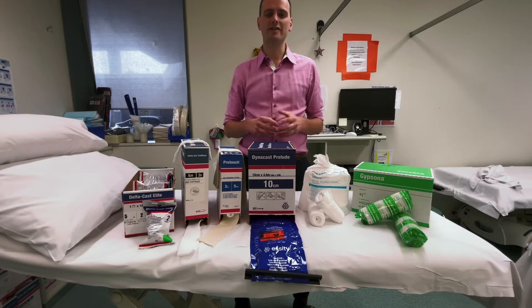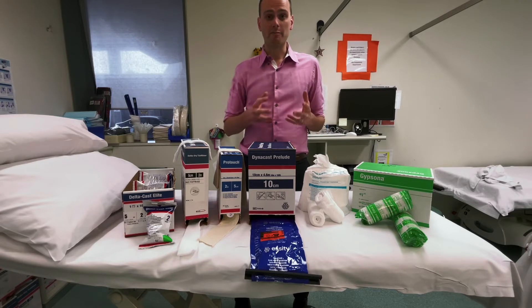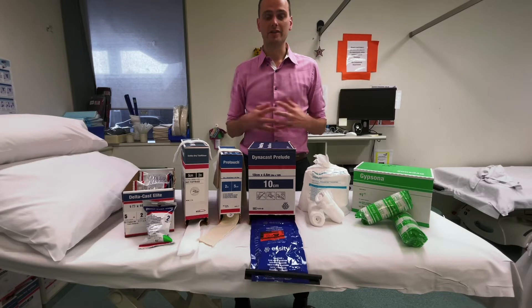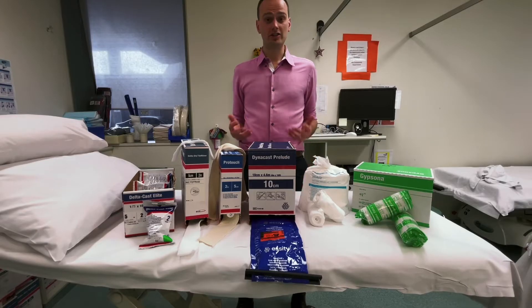Welcome back to the Osteoclass channel. This is the materials used in plastering in the basic series. Don't forget to watch the rest of this playlist in the link provided below. Today I'm going to go through some of the padding we use and the casting materials so you can become more familiar with the options you might come across in your institution. Let's jump into it.